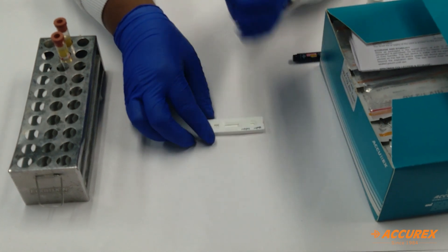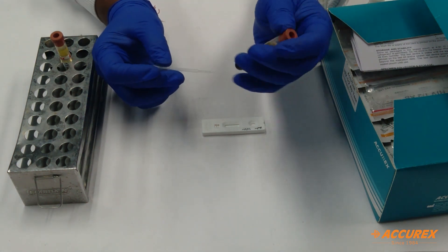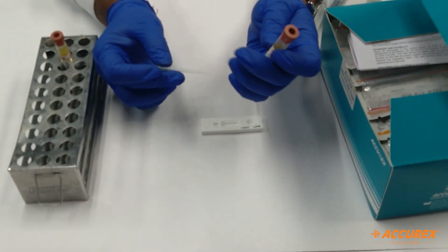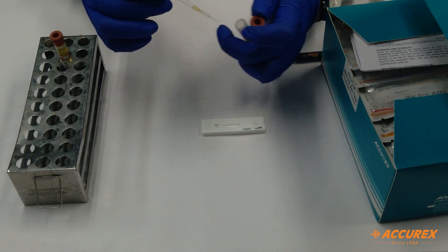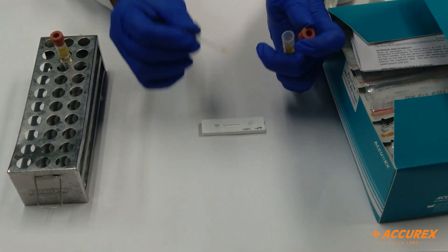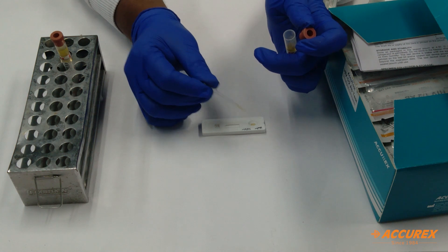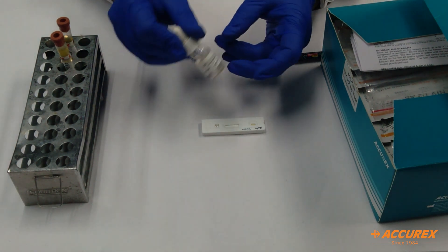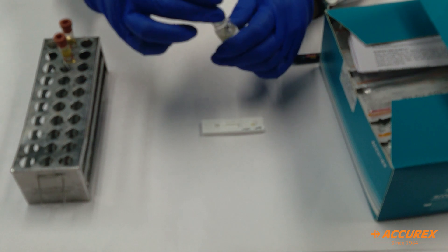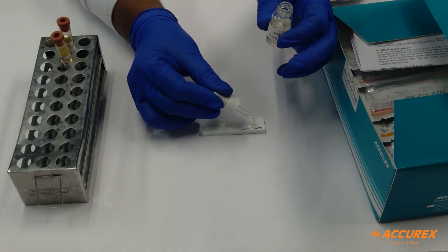For the testing, we will require the serum sample. I have already collected the serum sample in a plain tube. We will take one drop of serum, or 10 microliters, and add it to the sample well. Then we will add two drops of buffer.